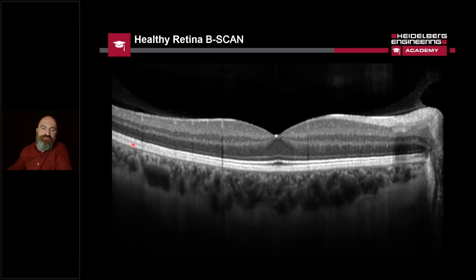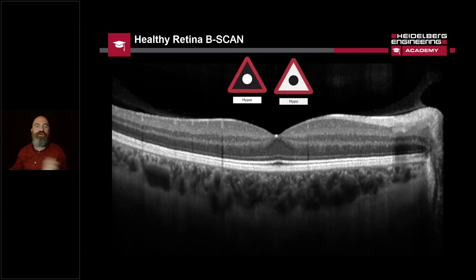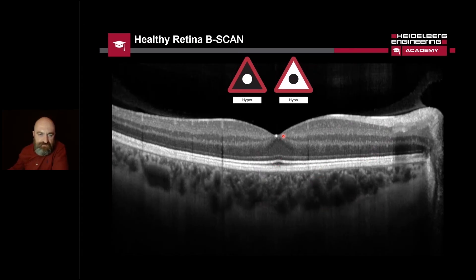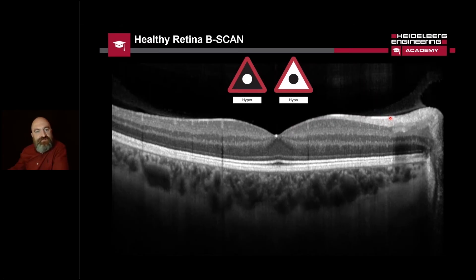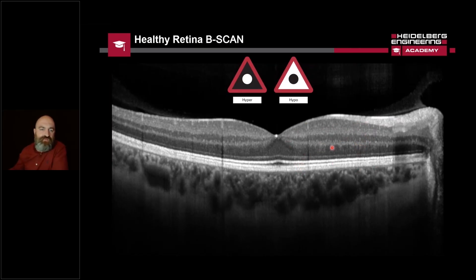We're going to use the hazards to describe what we can see on this normal scan, purposefully choosing two of those hazards. The B-scan — the brightness scan — means we're looking at the difference between light and dark. So we'll use the hyper and hypo hazards. Starting in the middle, you can see the little hot spot there in the right in the middle — that's very commonly known as the umbo reflection, which is absolutely normal. Across the surface, there's a bit of hyperreflection as well — that's just the vitreoretinal interface where you've got a very young healthy eye and the posterior hyaloid is sat flush against the internal limiting membrane, creating a little bright hyperreflection. That's not something to worry about like an epiretinal membrane.